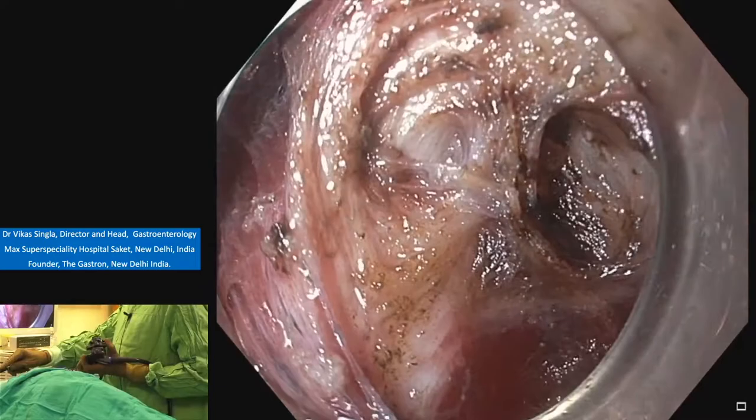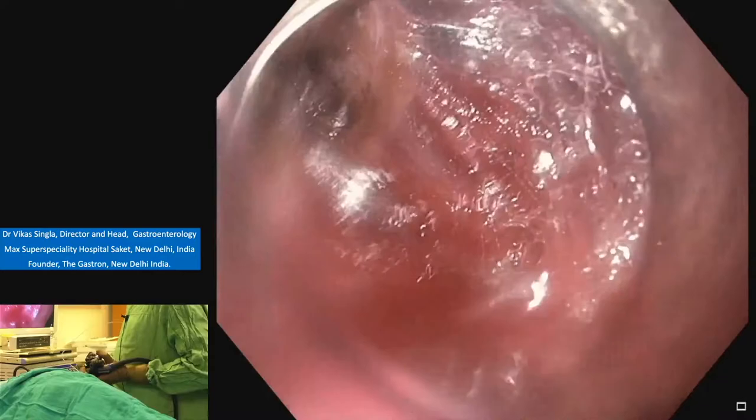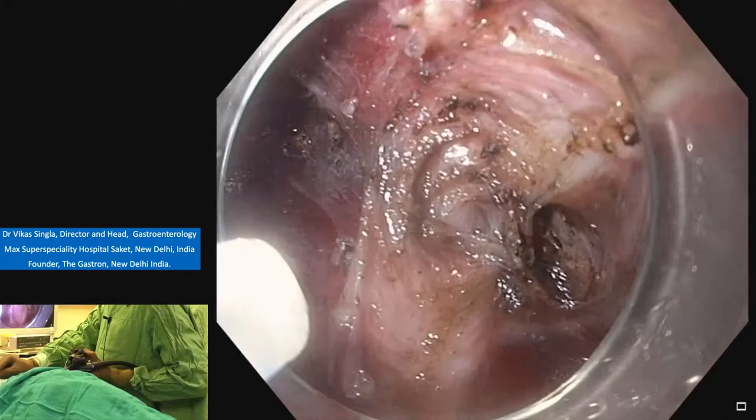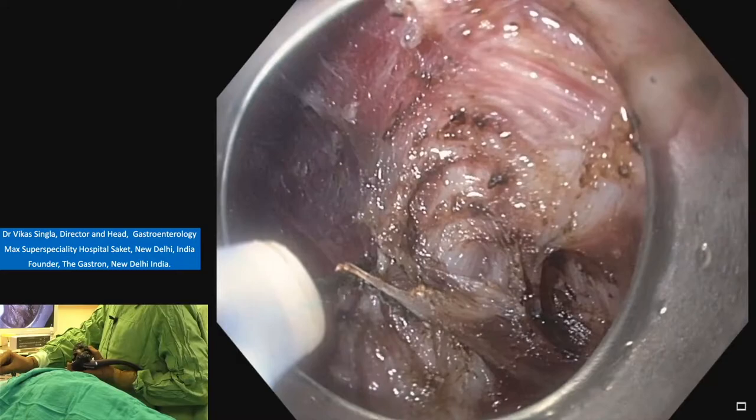Maybe last cut. Again, you can see that whenever we are approaching the gastric side, the number of vessels, whether it's around the muscle in the adventitia or in the muscle layer, goes up. And the chances of bleeding are high on the gastric side. So one has to be very careful. I'm cutting the last part very carefully.